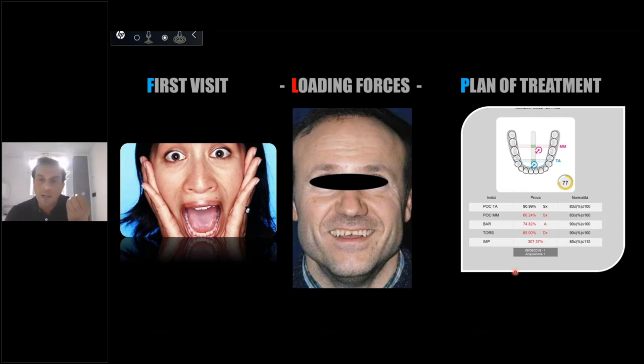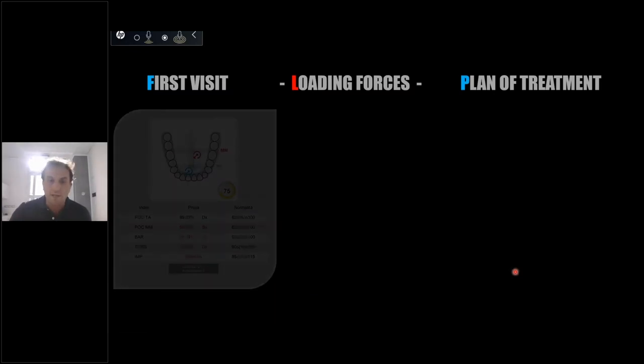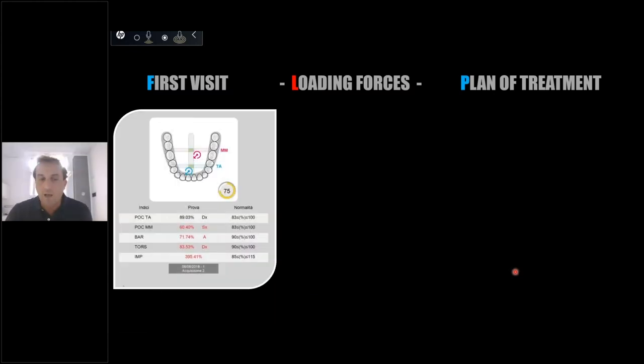But this type of device is so important because if you have this data, it's a very good piece of information for the future therapy. So I did a new exam on this patient, and this is the result. This is the impact after the new exam after 5 minutes. So I have an impact of 395, so four times more than the normality.